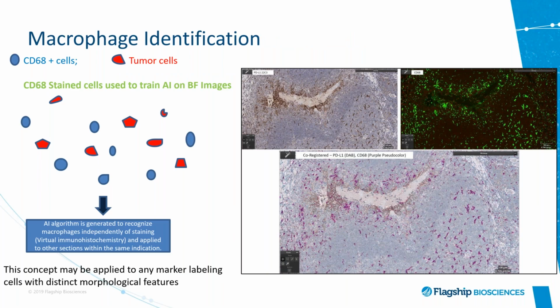Another important problem is often to identify whether macrophages are stained for PD-L1. This is a particularly important topic, as the role of macrophages in tumor immunology and in tumor protection has been illustrated by several papers. So we actually developed a system to identify macrophages from tumor cells using digital image analysis, utilizing basically a combination of immunofluorescence and immunohistochemistry on the same slide.